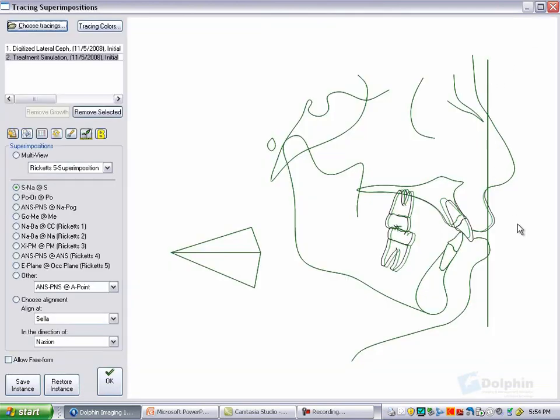So you can see that essentially the lower incisor remained in its position and the upper incisor is retracted. This will change the upper lip position very slightly, so this is a very easy incisor position to diagnose with this patient.